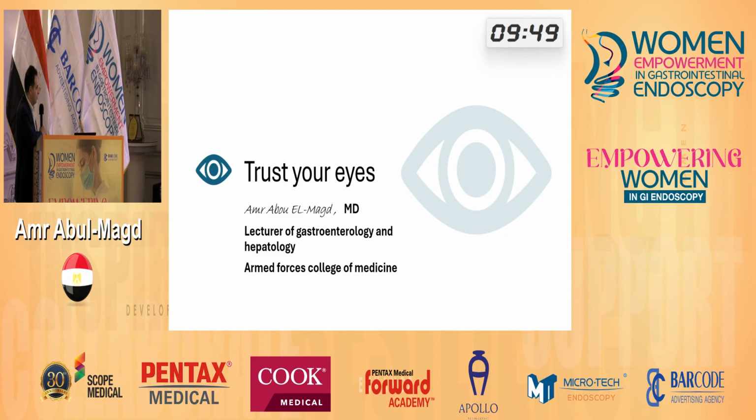Dr. Nada asked me to talk about a simple case of FNA or FNB. I found this simple case really helps you to trust your eyes and your needle.